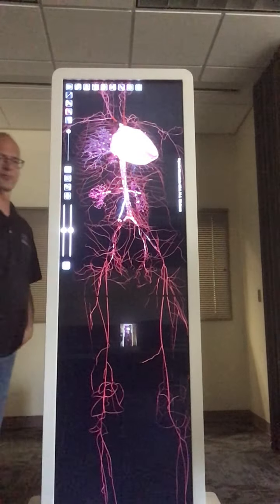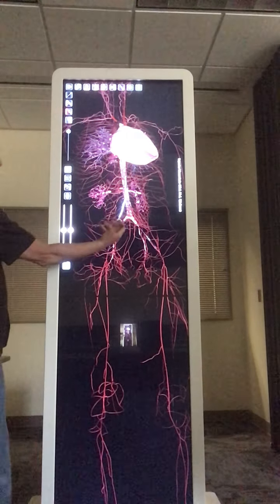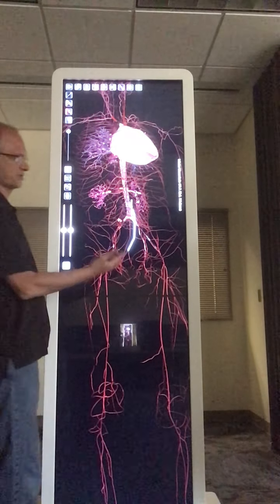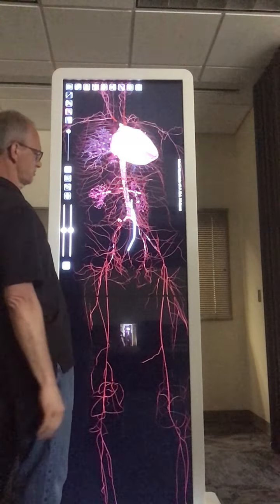There it is. There, it lets me label that one. That's called the superior mesenteric, and that's supplying mostly small intestine. And if I come down here, there's the inferior mesenteric, which is supplying mostly large intestine. So we can see all of the branches that are coming off of that aorta are very important for the organs they serve.